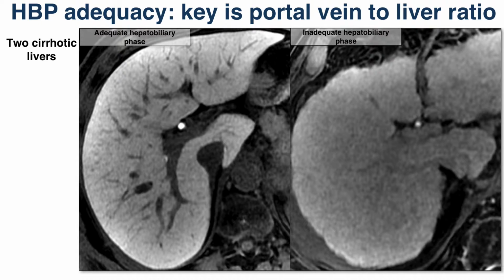So evolution has made it in such a way, the liver has evolved in such a way that when it starts to get sick, it ramps up the ability to excrete toxins. So MRP2 expression goes up. So whatever gadoxetate gets into these liver cells, it promptly gets excreted. So do not use the biliary system as your clue to whether the image quality is adequate.